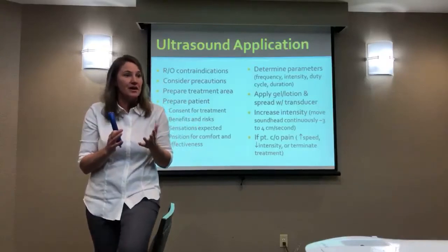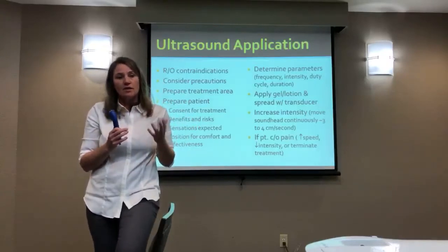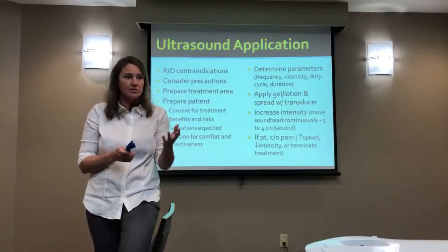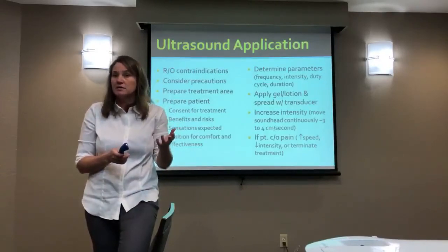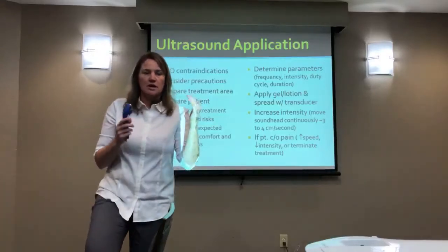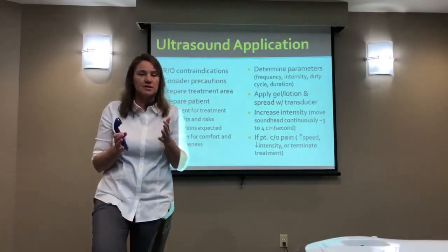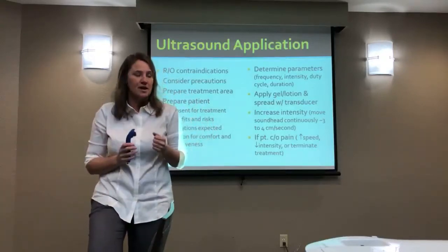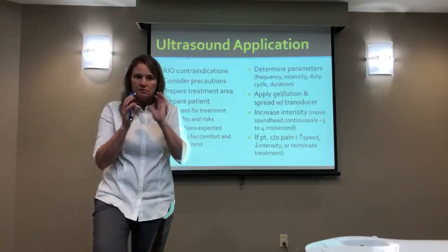It's really tough. So one of the things I challenge people to do is do ultrasound on yourself. Different ways. In a lab type environment, I'll tell people, if you're trying to do a thermal treatment, this isn't for a therapeutic outcome. This is for education and just to learn for yourself. Do ultrasound. Get a setting.